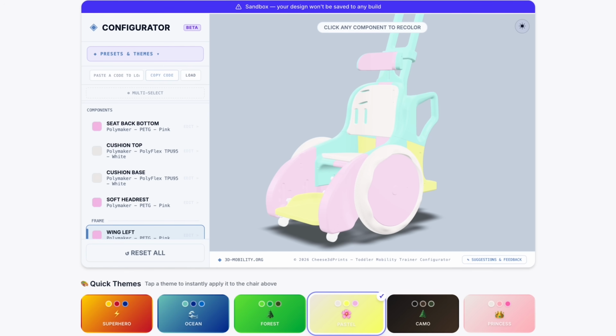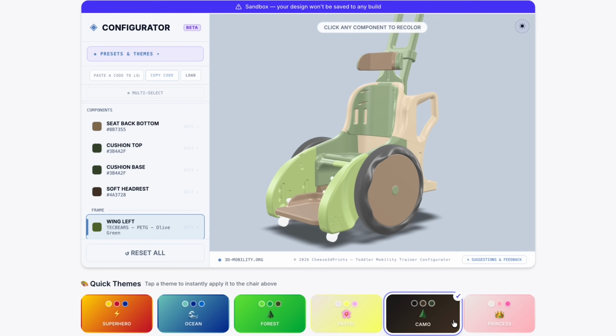I knew what a TMT looked like, but it was hard for me to visualize it. And I just sort of picked the colors that I thought would work for the wheels, for the sides, and then in the middle, and then the straps. But with the chair configurator, being able to pick the color per piece and then export a PDF showing the angles of it, oh, this is perfect because as a maker, this gives you a really good idea of what your making is going to look like.